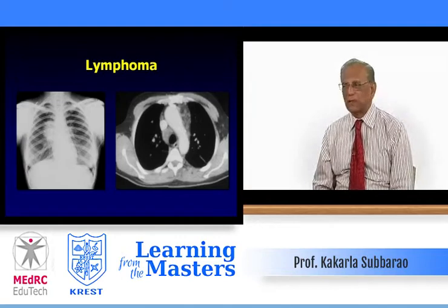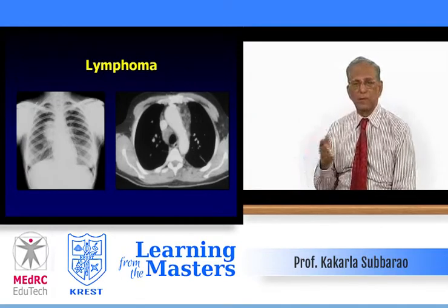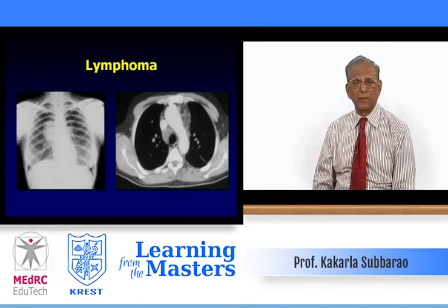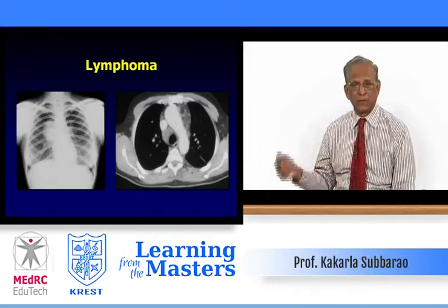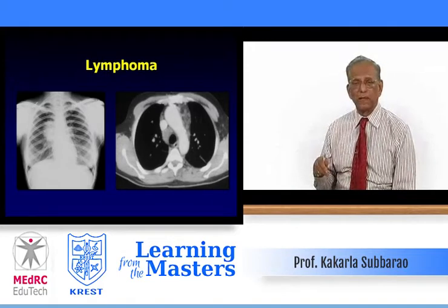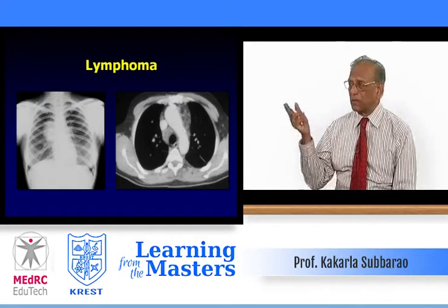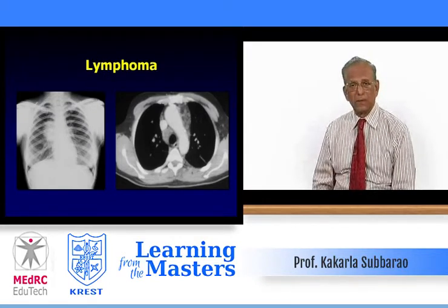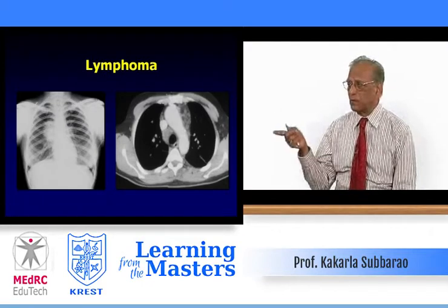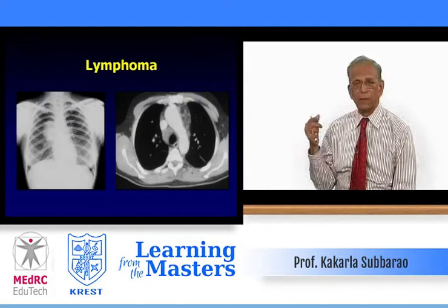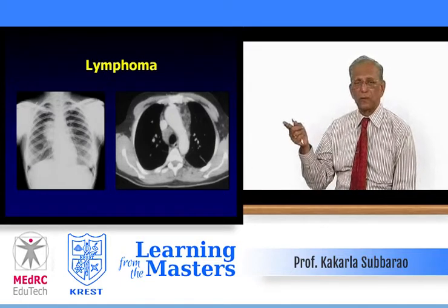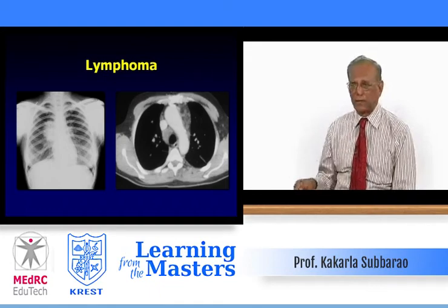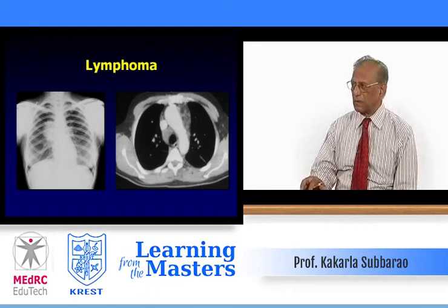Then we come to lymphoma. On a PA view there is a large right hilar mass — we know it is nodes, particularly in children, because bronchogenic carcinoma doesn't usually occur in childhood. The lateral view also shows a nodal mass. On CT you can see there are nodes along the aorta, in the anterior mediastinum, below the superior vena cava, and along the paratracheal area. This is lymphoma.